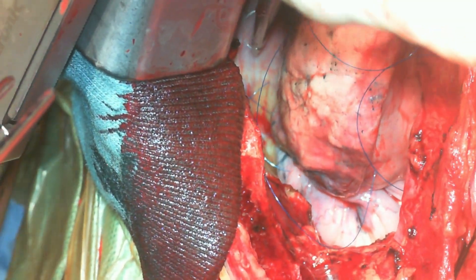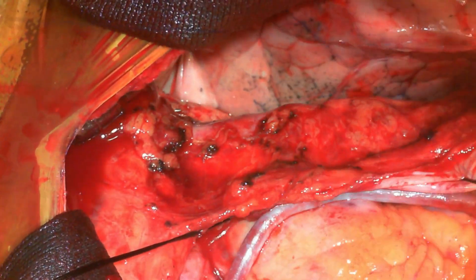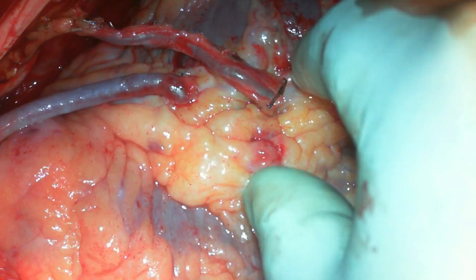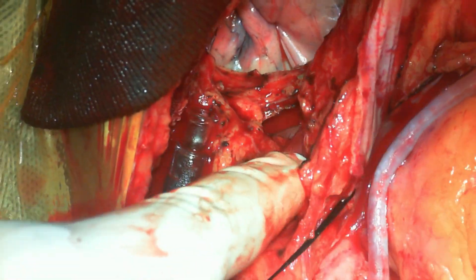By doing so, you will see that the LIMA will be lying loose on the medial surface of the left upper lobe, across the pericardial cavity and onto its way to the LAD, with enough length.